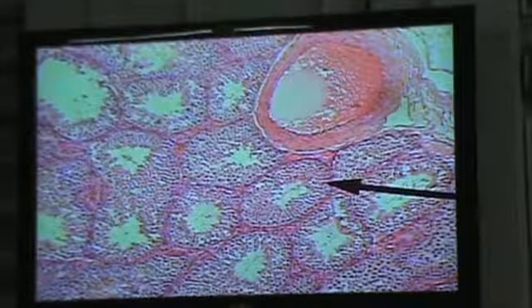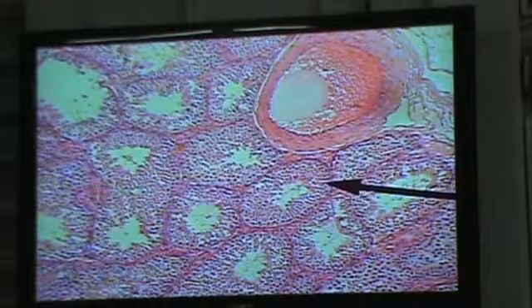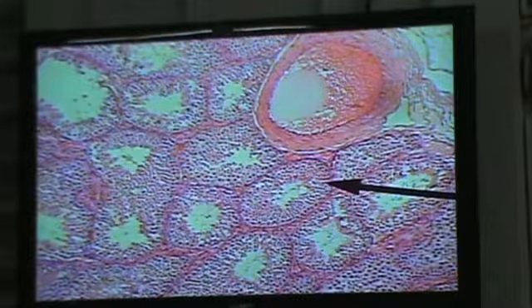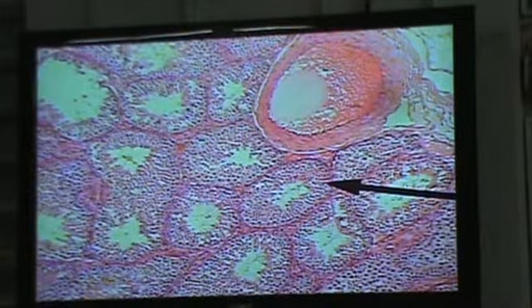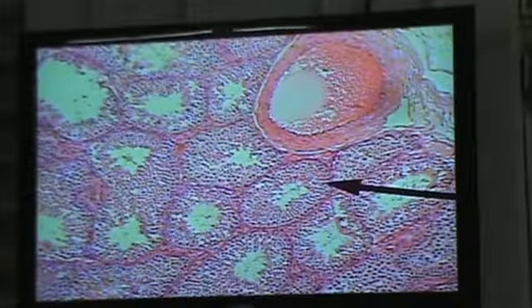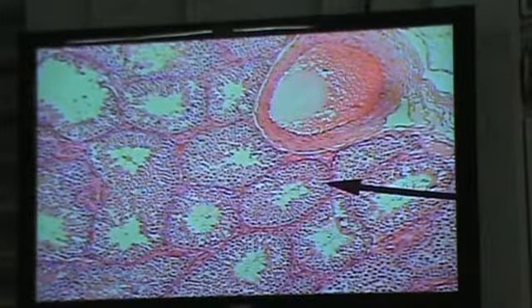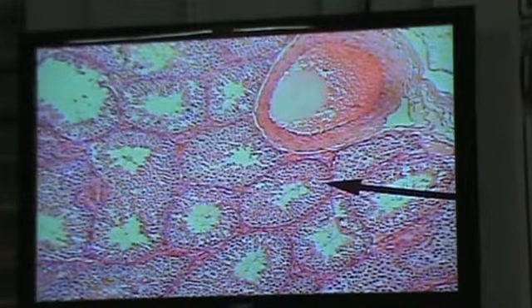From there, about 10 or so small tubules leave, and those small tubules are called the ductuli efferentes. And these ductuli efferentes now drain into the epididymis. The duct of the epididymis, which is a long structure, okay? And very interestingly, having these highly specialized structures known as what? Stereocilia, okay? If you want, you can read all about stereocilia.